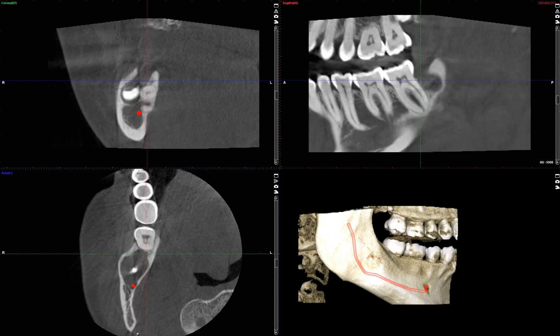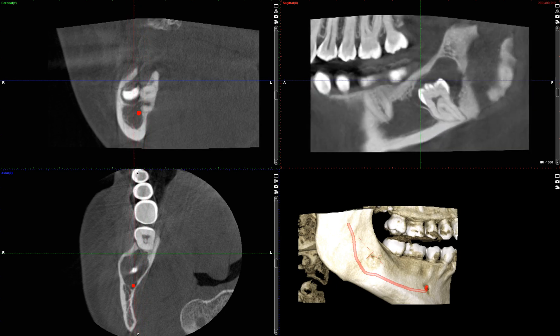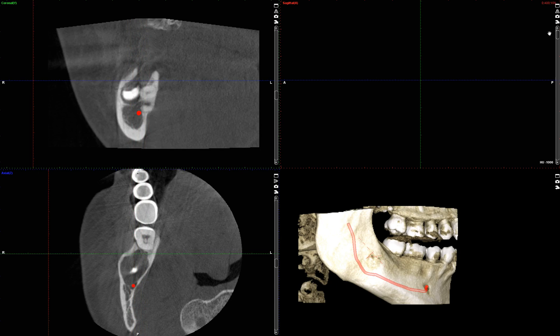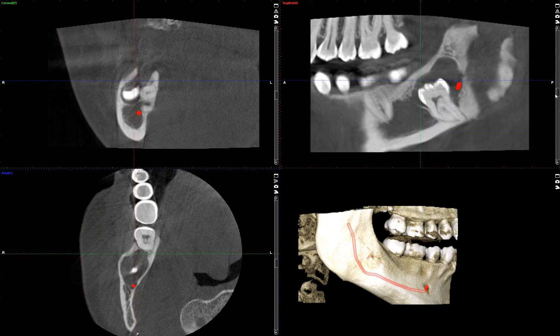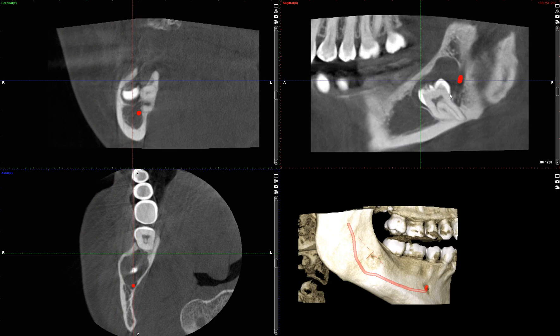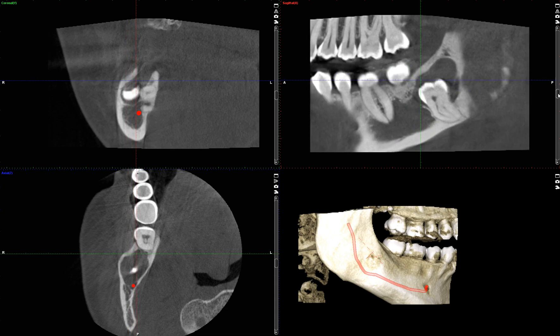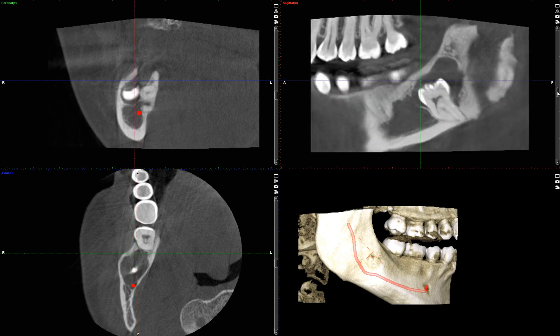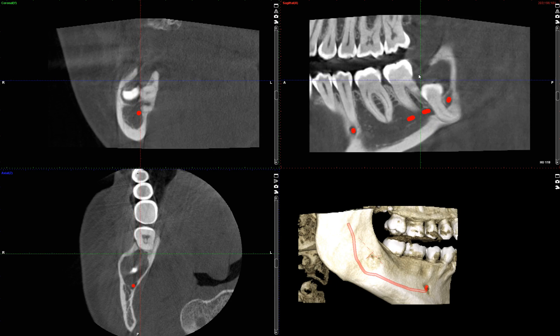Here we have an impacted third molar. We have a well-defined, corticated, pericoronal radiolucency associated with impacted tooth number 32. This tooth is impacted so far inferiorly that the root apices are embedded within the inferior cortex of the mandible. This lesion has also caused disruption of the alveolar crest, as you can see just above the crown of number 32.